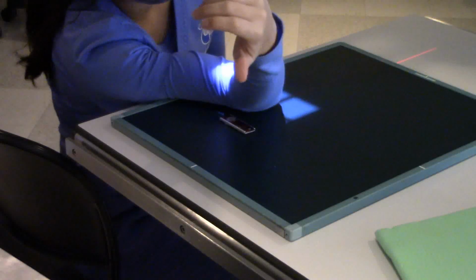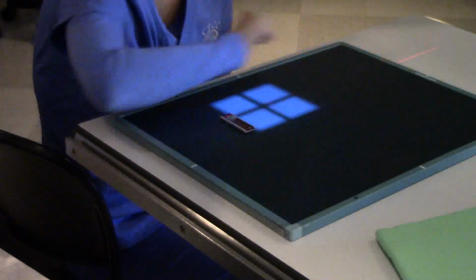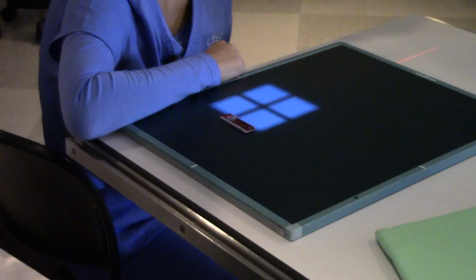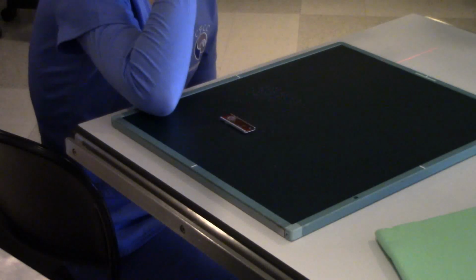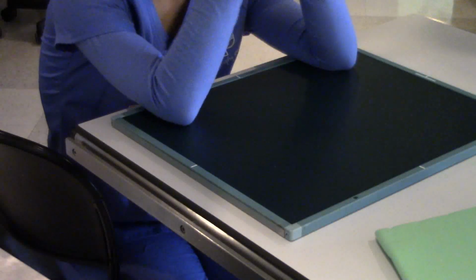But in reality, a lot of times when people come in with a real injury to their elbow, they've got it cradled. They're holding it like this. So for somebody holding their elbow like this, you can slip the image receptor between the patient's body and their elbow, and shoot through for a lateral, and get a preliminary image to see if there really is a break there.